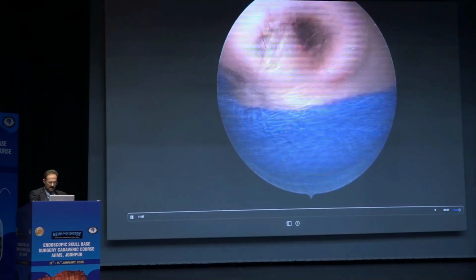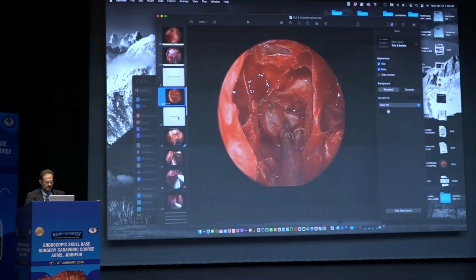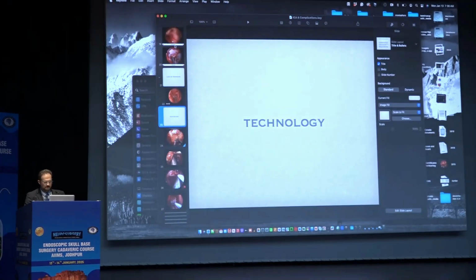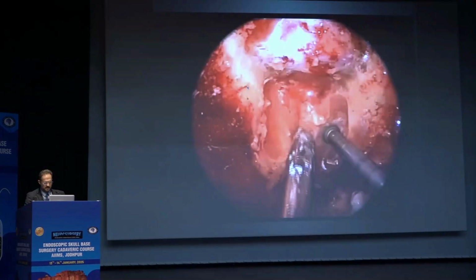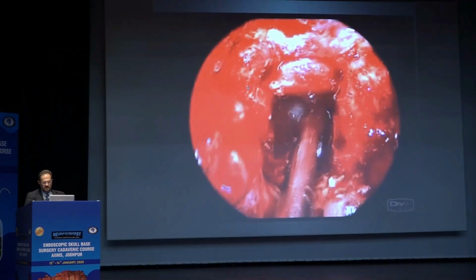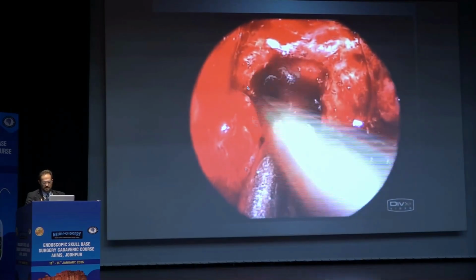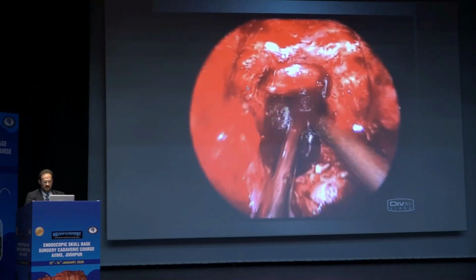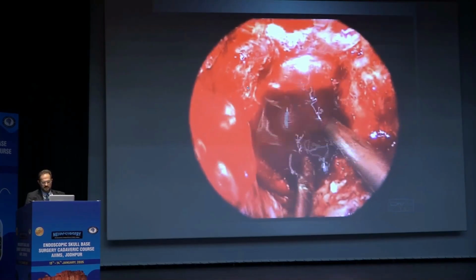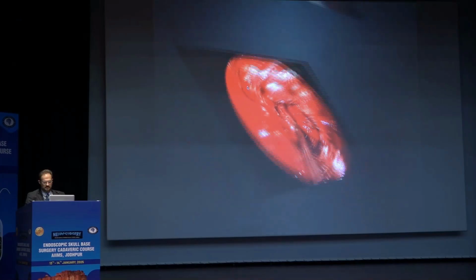So let me just pause here and tell you, in terms of things to do, let me show you this other one related to technology. This is venous plexus bleeding. This is the one that works very well with Floseal or Spongostan or the other brands. This is the way for venous bleeding; it works very well. But don't do this if the blood is arterial.